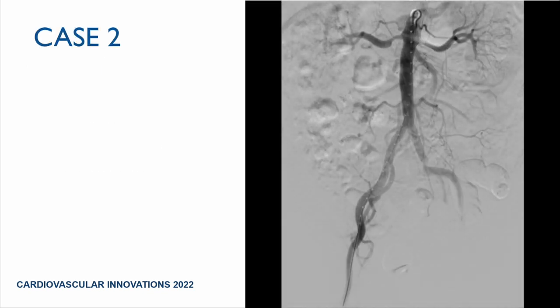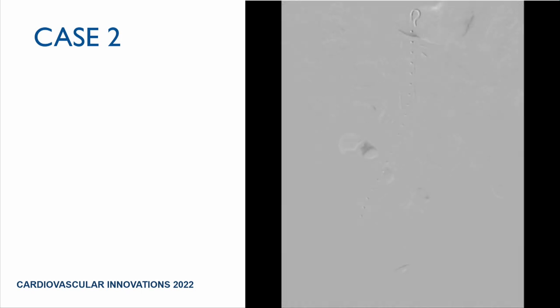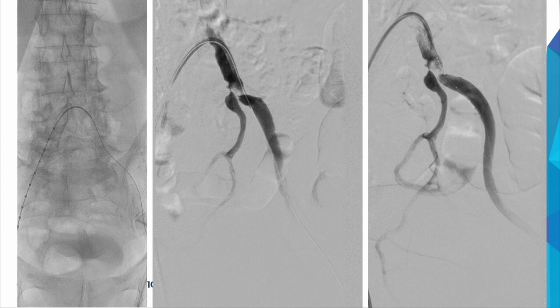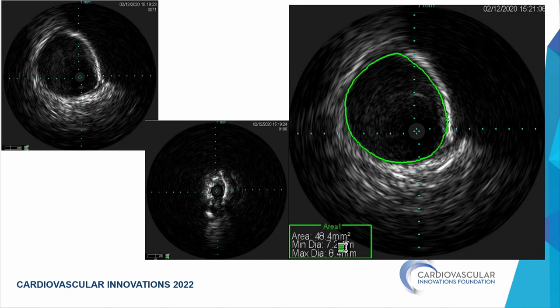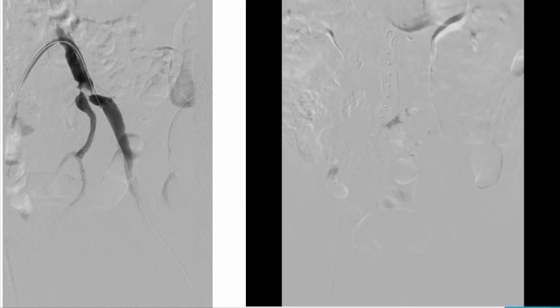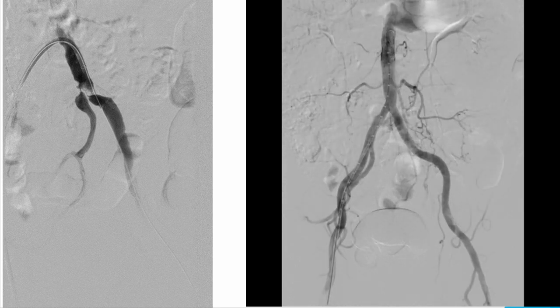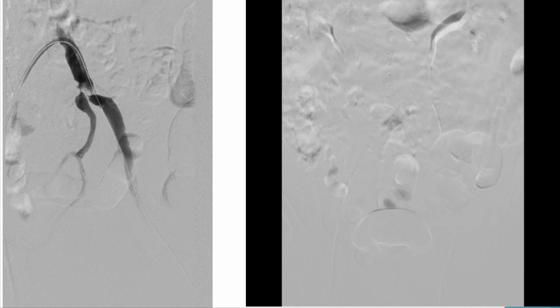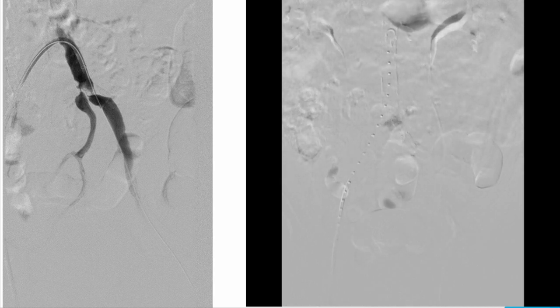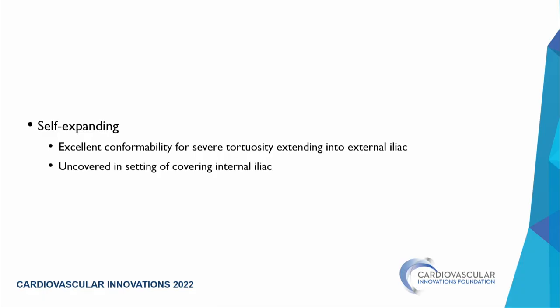A more complex case: a lesion at the origin of the external iliac artery and bifurcation of internal and external iliac, with size discrepancy and tortuosity also compromising the internal iliac. IVUS was used for sizing. The lesion was not densely calcified, so serial slow balloon inflation was performed, then a self-expanding stent was placed. A covered stent was avoided to prevent complete jailing of the internal iliac. This demonstrates how self-expanding stents allow conformability to tortuosity with good in-and-out treatment.